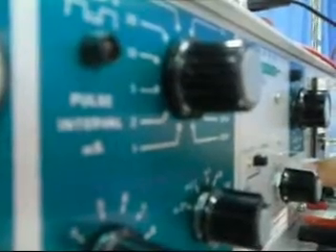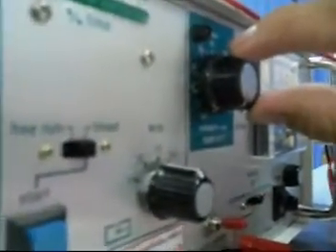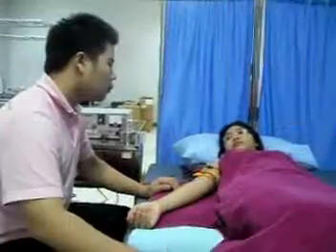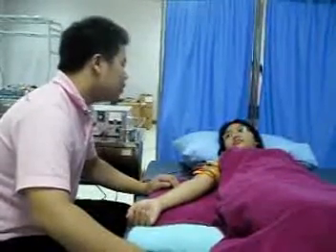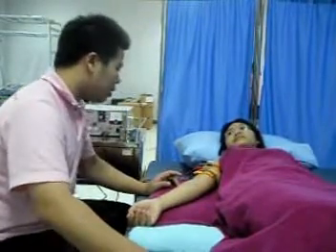And time is 15 to 20 minutes. And then you can adjust the intensity to maximum contraction. Just a moment, I release the electrical current to you. If you feel a pricking sensation, you can call me.